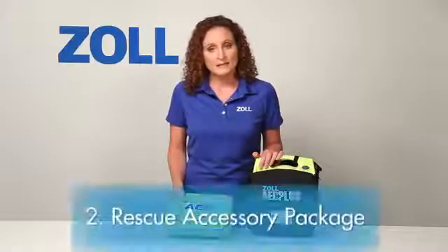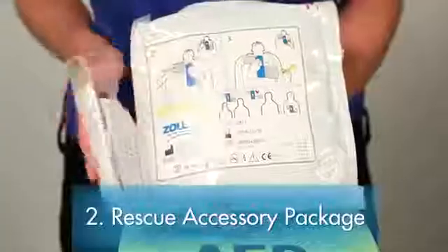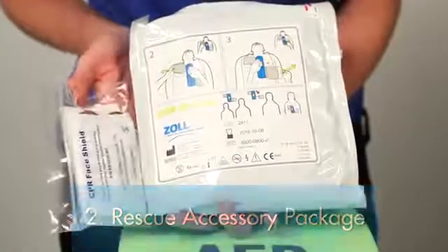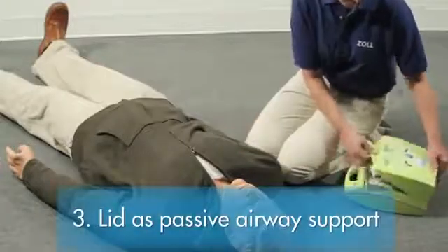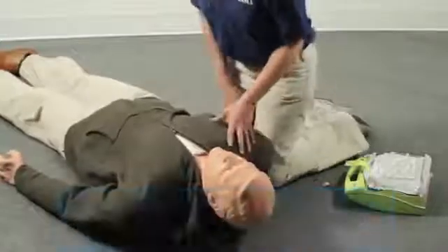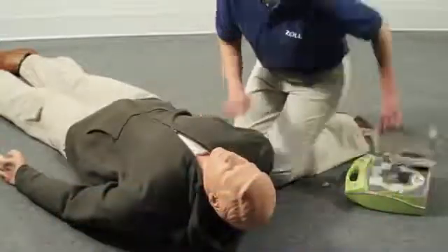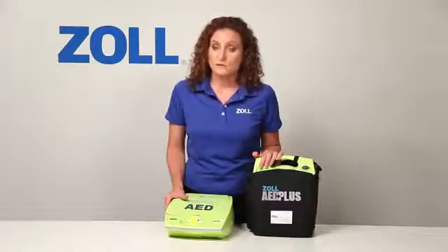The second element of best support: every CPR-D pad has a rescue accessory package attached. The third element: the lid of the AED Plus can be used as a passive airway support system to maintain the victim's open airway. A resuscitated victim may not breathe freely without this sort of support.